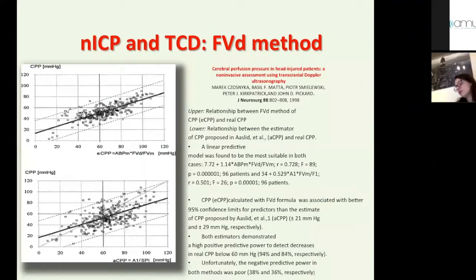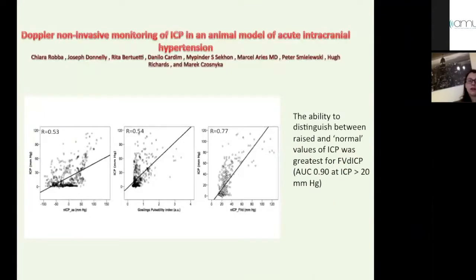And this method, I'll tell you in advance, has been used by the group of Brescia to develop a multicenter study which is going on. There are something like 20 centers involved, and from the preliminary results, we found that this method is able to discriminate intracranial hypertension in 99% of our patients. So in clinical practice, I think this is a very important method.